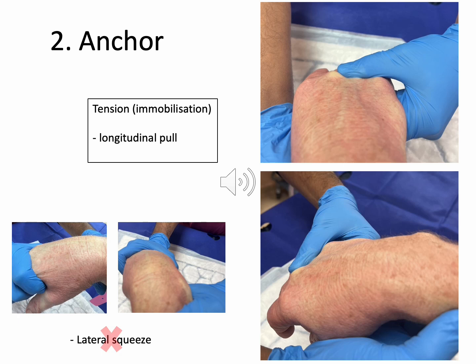You can see in the lateral squeeze slides that when you squish the hand from side to side, it results in squashing and flattening of the vein. When tensioning the vein, it is important to keep your tensioning thumb far enough back from the point of insertion into the vein so as not to interfere with dropping your angle once you have entered the vein.